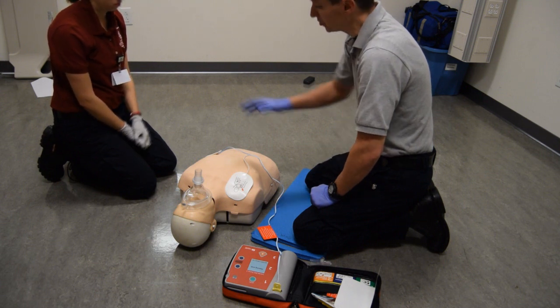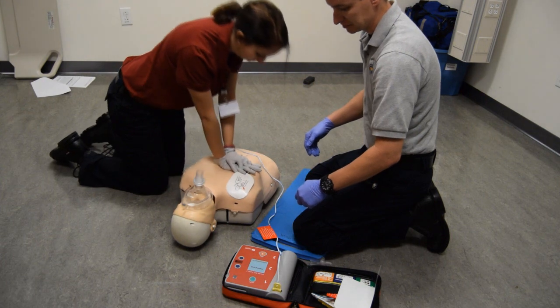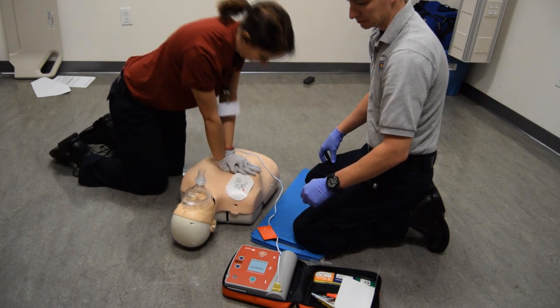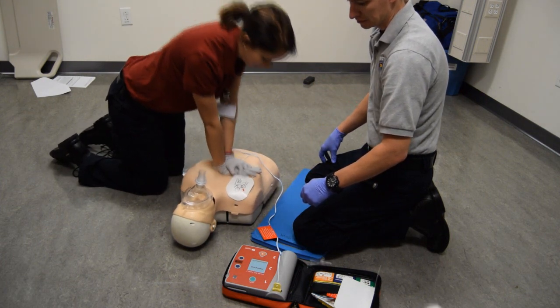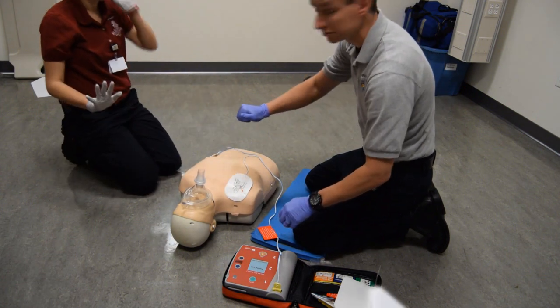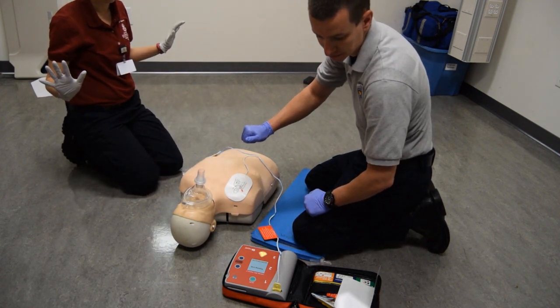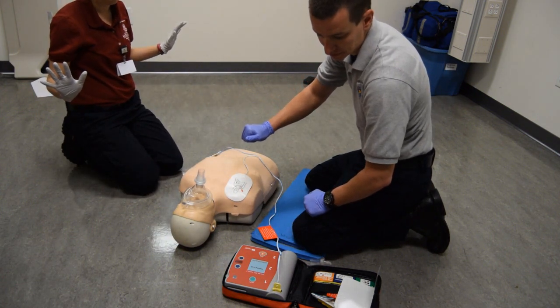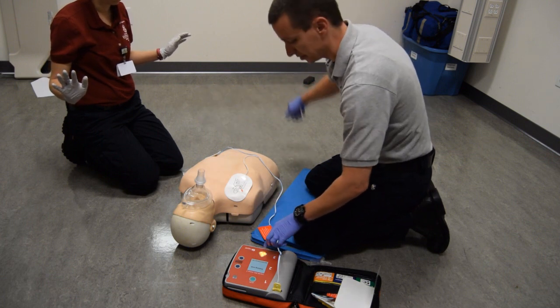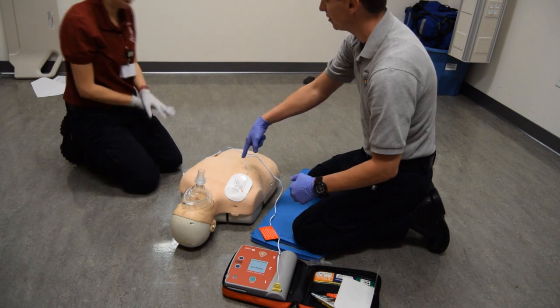The candidate stops CPR and ensures all individuals are clear of the patient during rhythm analysis. Shock advised. Will you do CPR while I charge? Stay clear of patient. Deliver shock now. I'm clear. The candidate ensures that all individuals are clear of the patient and delivers the shock from the AED. I'm clear. You're clear. Everybody's clear. Immediately get back on the CPR.